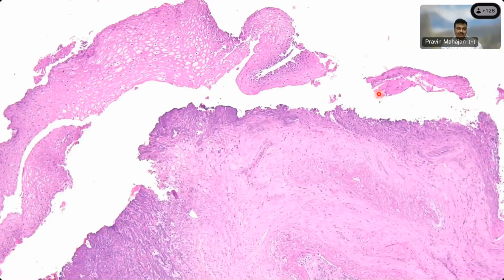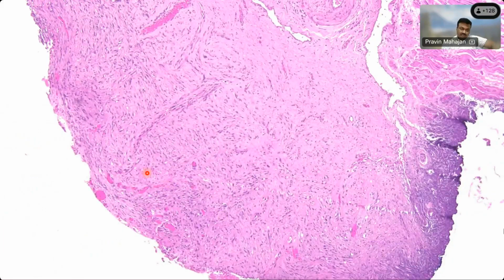And now here you see squamous epithelium, nicely glycogenated squamous epithelium, which is good for this site. It looks benign, no dysplasia. You cannot see anything in this subepithelium, apart from a thick-walled vessel and some fibrosis. But in some areas you start to see a spindle cell proliferation, rather bland looking, at least on this power, and very haphazardly arranged, maybe in some weak, short fascicles, but haphazardly, at this area which I am pointing to with my laser pointer.